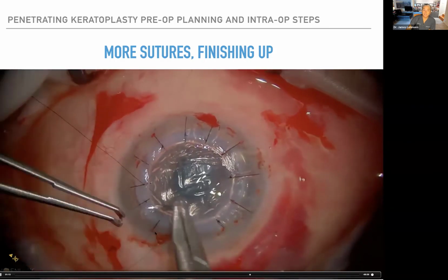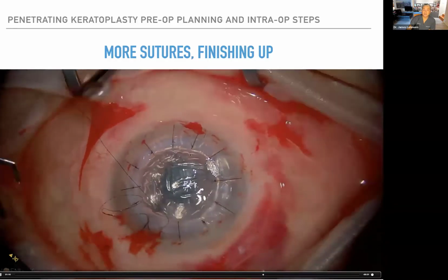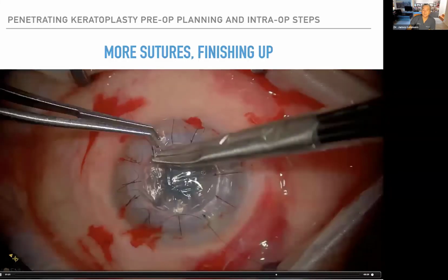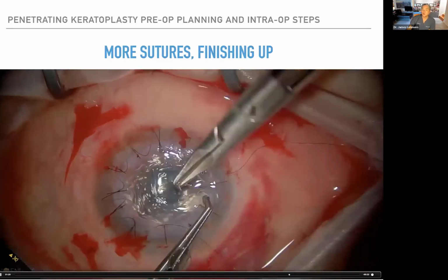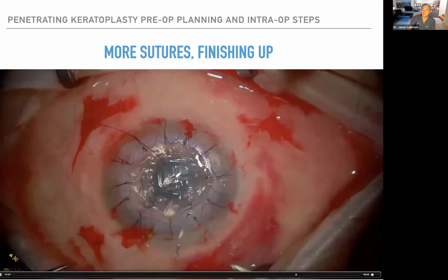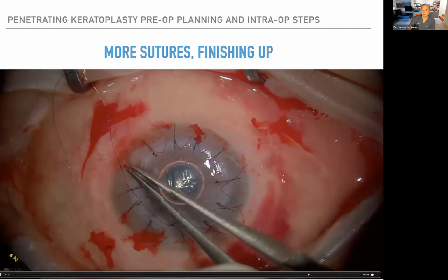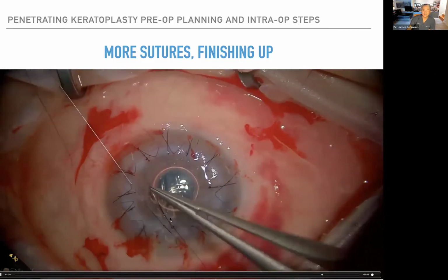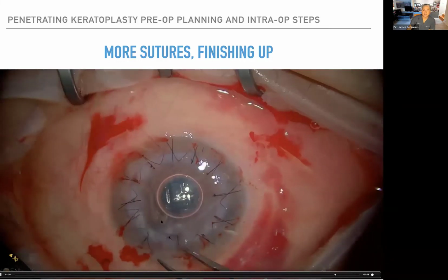Now I'm going to do my running suture. This is an anti-torque suture, and it's going to go in between all of these, but I do it either with an air bubble or BSS in the anterior chamber, not with viscoelastic. I want the eye at normal pressure. I don't want it soft because I want this suture to not be as tight as the other one. So once I've tied a knot, I go around and I take any slack out of the system. Okay, and then I tie it, I cut it, and then I bury it.